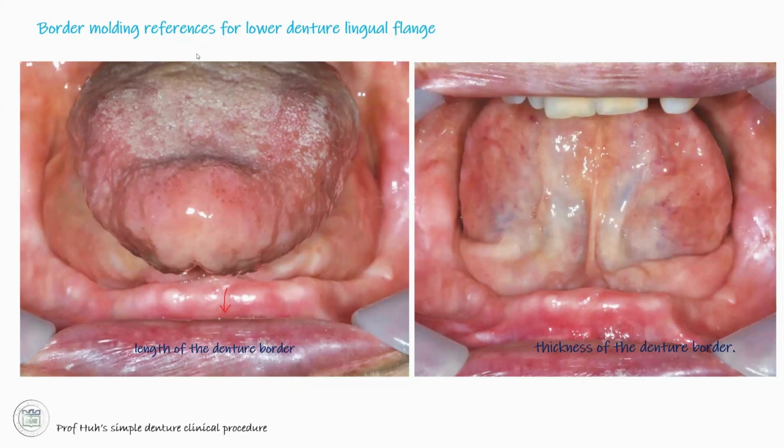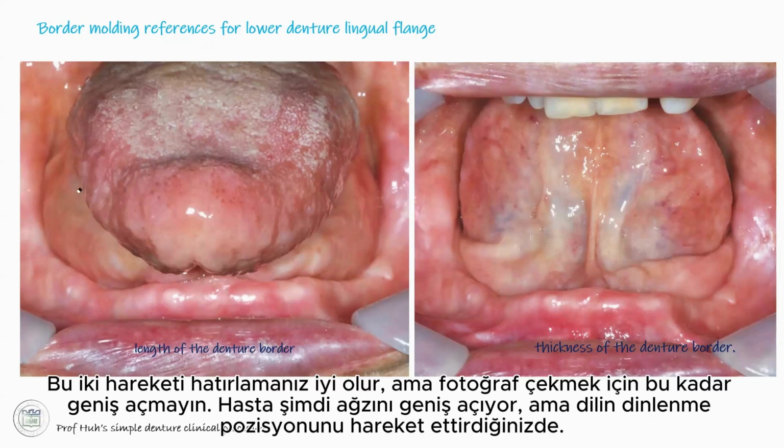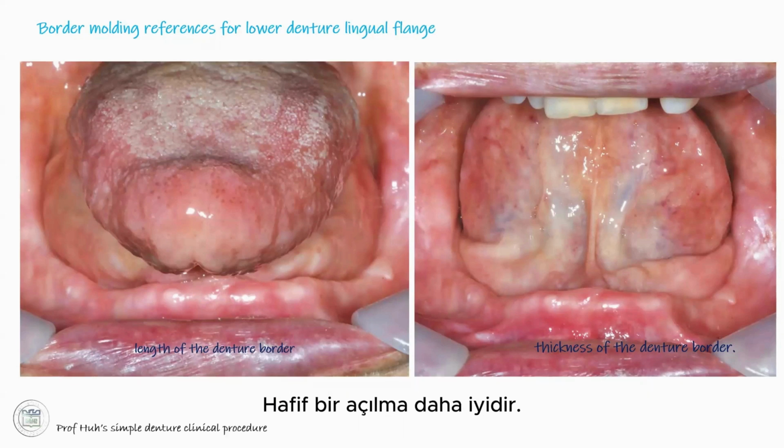Okay, you had better remember these two motions, but don't open widely like this. To take a photo, the patient is opening the mouth widely now, but when you move the tongue, the rested position with slight opening is better. Slight opening, okay?